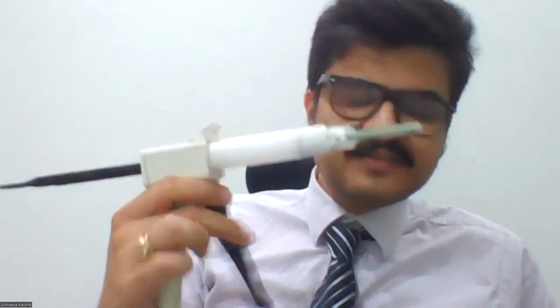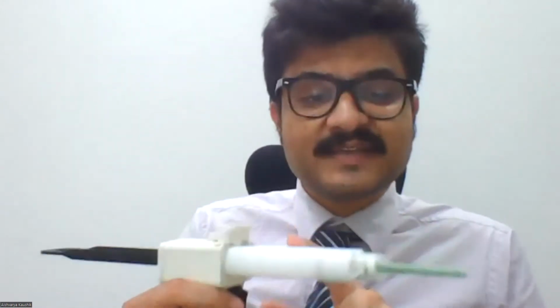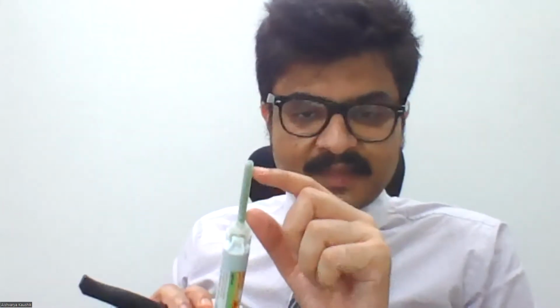Now, if I attach the cartridge, which has got two tubes, one is the base paste, the other is the catalyst paste, I attach it well to this gun, right? And I fit this well here. Now, when I'm pulling the trigger, the plunger is forcing both the base paste and the catalyst paste into the mixing tip. Now, this is where it gets interesting, right? This mixing tip is where the principle of static mixing takes place. That is known as flow division. Static mixing is based on the principle of flow division.